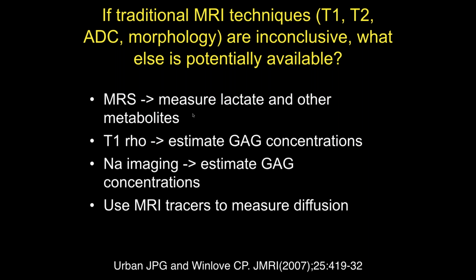A company we worked with 7 or 8 years ago to get data on this is back now, and supposedly we're going to start doing studies on actual patients here in Southern California using lactate. We purchased a 3T Siemens scanner specifically for these studies in the Inland Empire, and we may start doing clinical patients because I think they've gotten FDA approval for this technique.